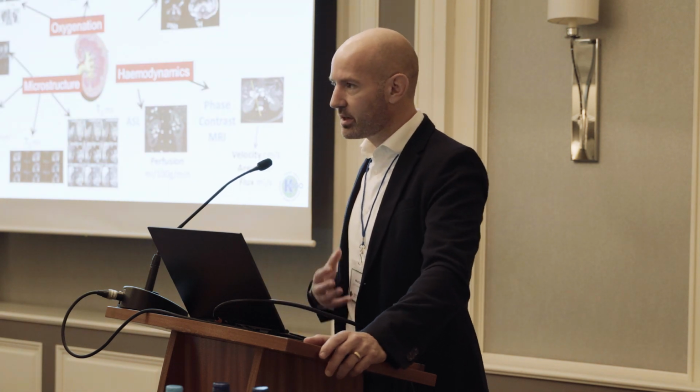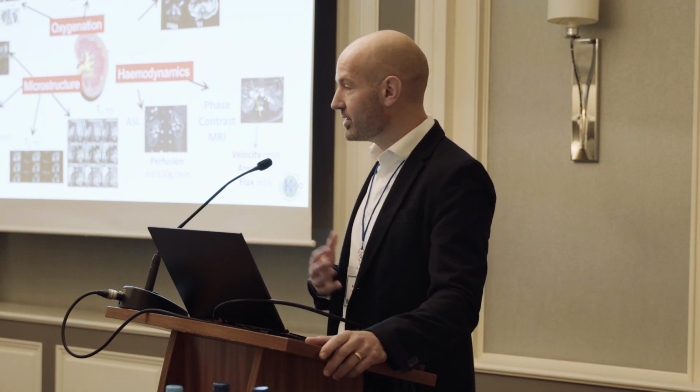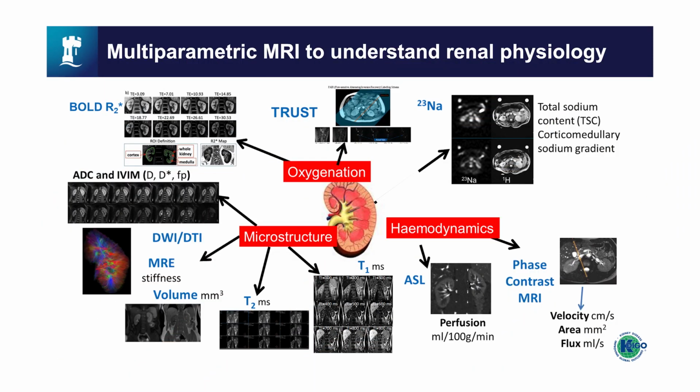So against that, we've seen a number of developments in the last few years, and there are now MRI techniques that you can see might map directly to a number of those different processes. So MR can assess different aspects of kidney structure and function, blood flow and oxygenation that might provide really important mechanistic insights into CKD. Importantly, these different measures can be combined within a single 1-hour scan session, and none of the approaches that I'm going to talk about today involve contrast, so all are gadolinium-free. And I think it might be worthwhile just quickly talking through some of these different measures.